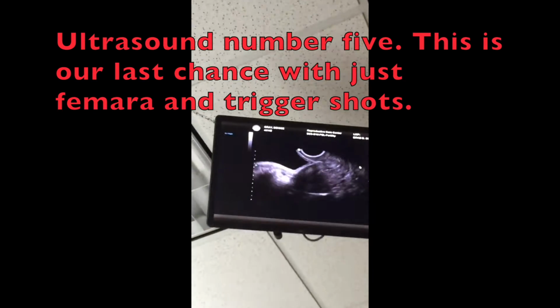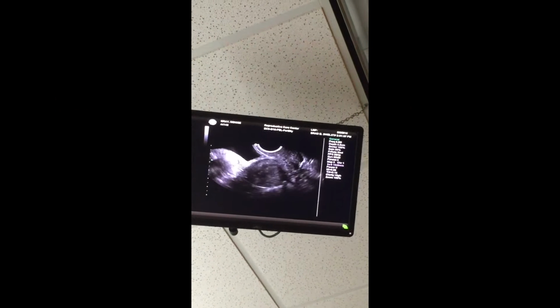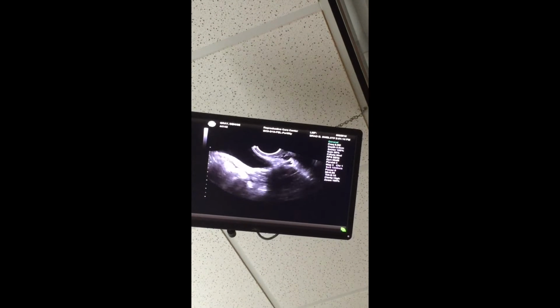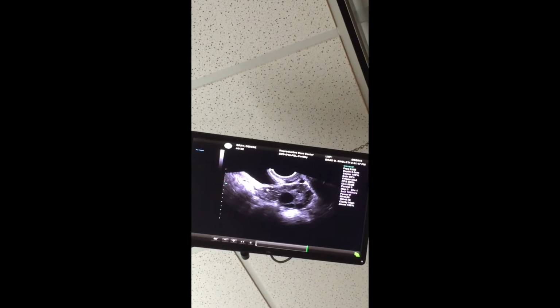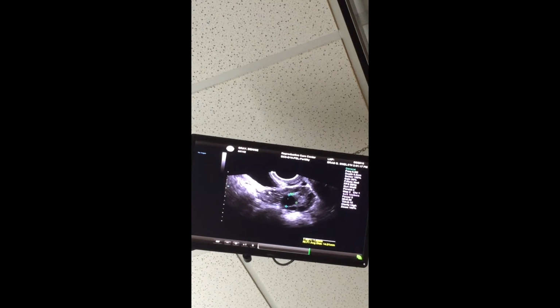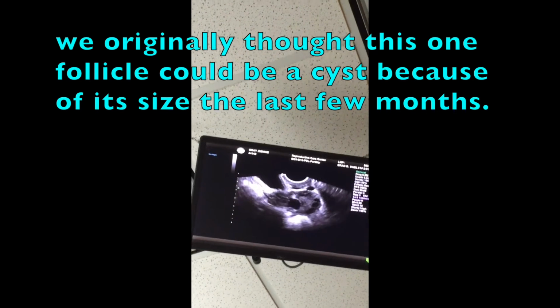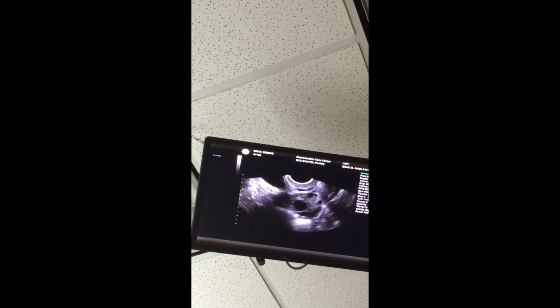Here's the uterus. We'll try to lighten that up a little bit. There we go. And then let's look at these ovaries. Is this the right side? That's the right side. So let's measure this. It definitely looks smaller, so that looks more normal in my opinion. Not a cyst. Here's a bunch of smaller ones. Oh, so you feel comfortable that it's not a cyst? Not yet. I have to keep looking.